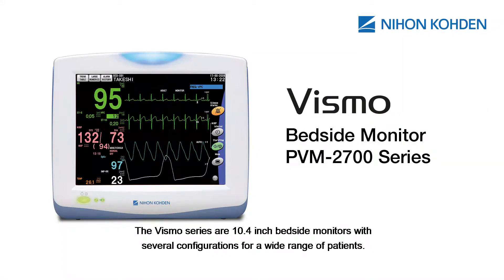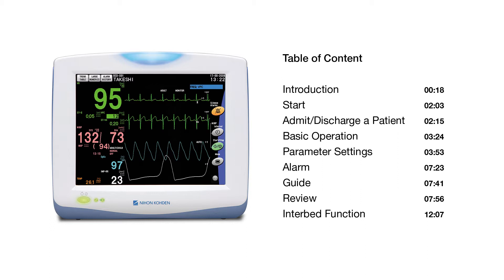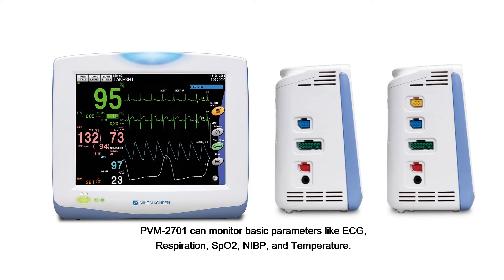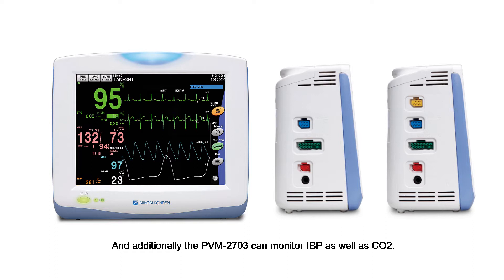The Vismo series are 10.4-inch bedside monitors with several configurations for a wide range of patients. There are two models. PVM-2701 can monitor basic parameters like ECG, respiration, SpO2, NIBP, and temperature. Additionally, the PVM-2703 can monitor IBP as well as CO2.